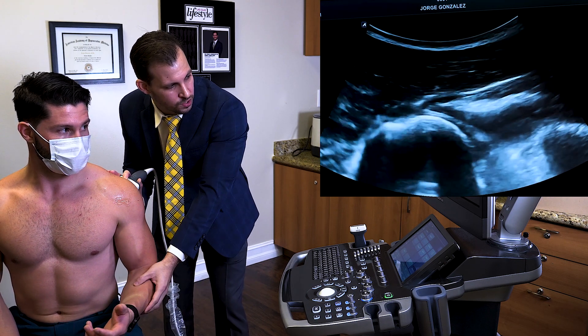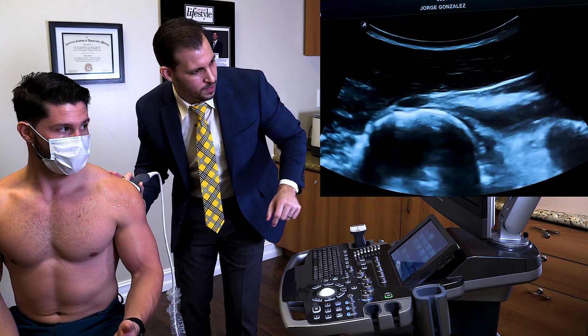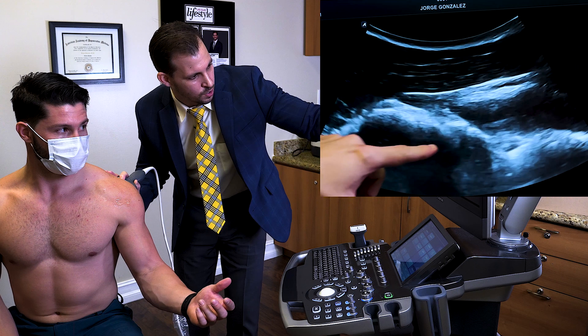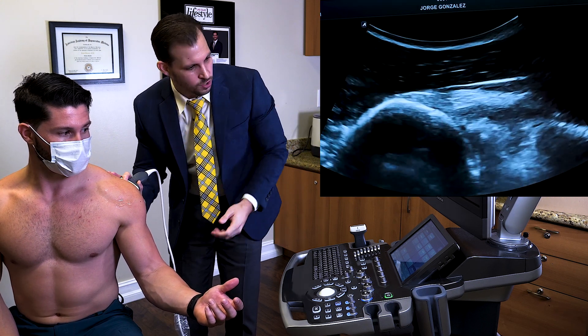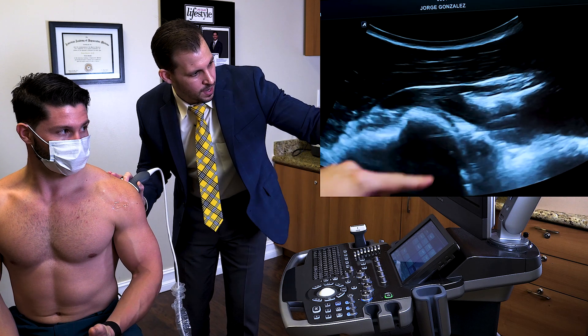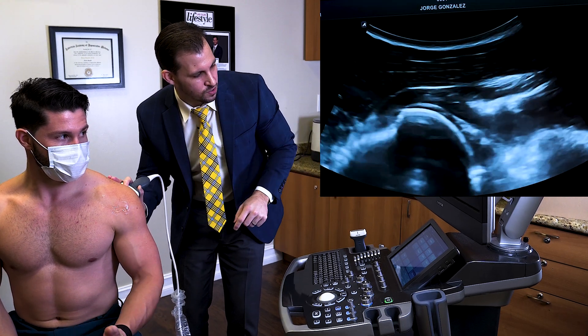We could dynamically stress and observe a couple of things. We already talked about the infraspinatus. Now I'm going to concentrate and look at the labrum — you could see a portion of that nice triangular structure. Roger, rotate your hand please and keep on doing it. We could get a good visualization of that.